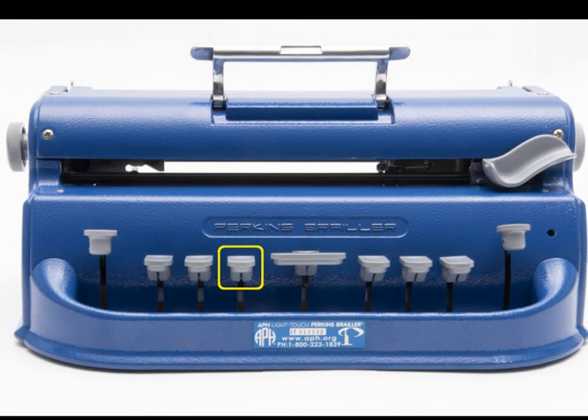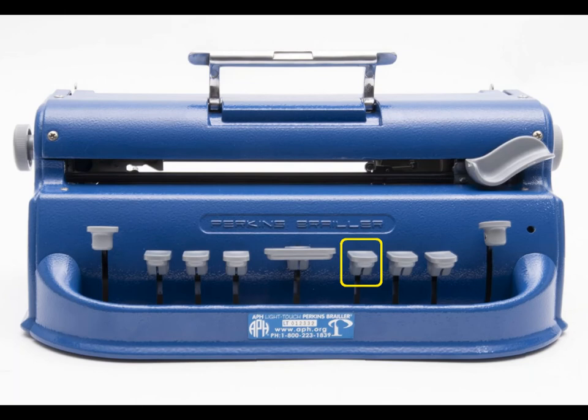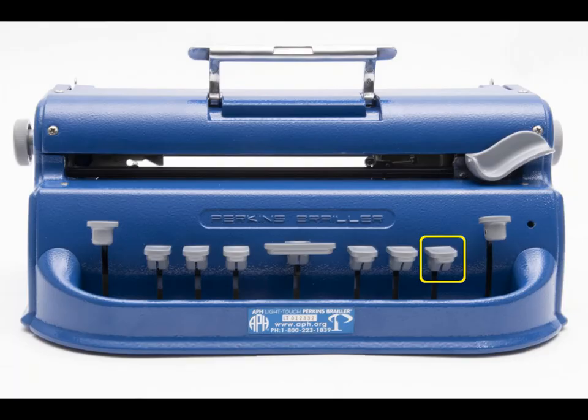The next key is the space bar, which works the same as the space bar on a laptop. These next few keys are the dots that form the right side of the Braille cell. The first one after the space bar is the dot 4 key, the one after that is the dot 5 key, and the last one is the dot 6 key.